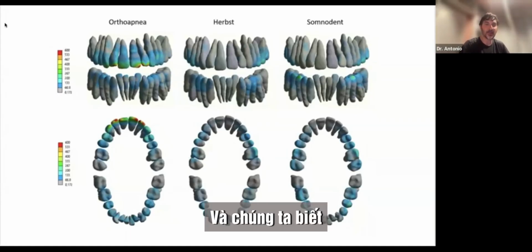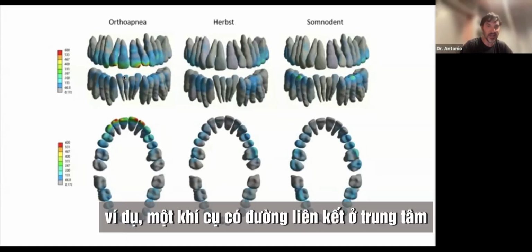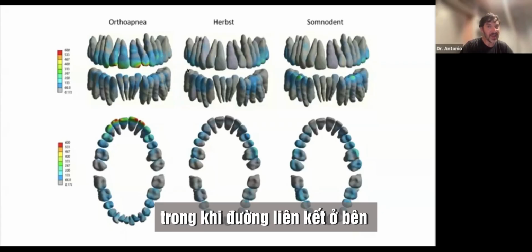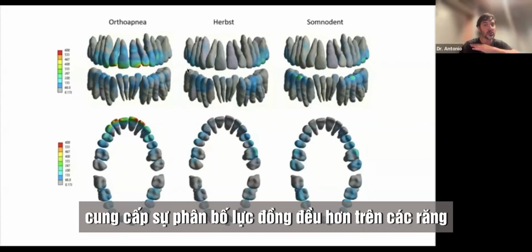And we know, for example, that a central connection device could affect mostly the anterior teeth, while the lateral connection provides a more uniform distribution of the load on the teeth.